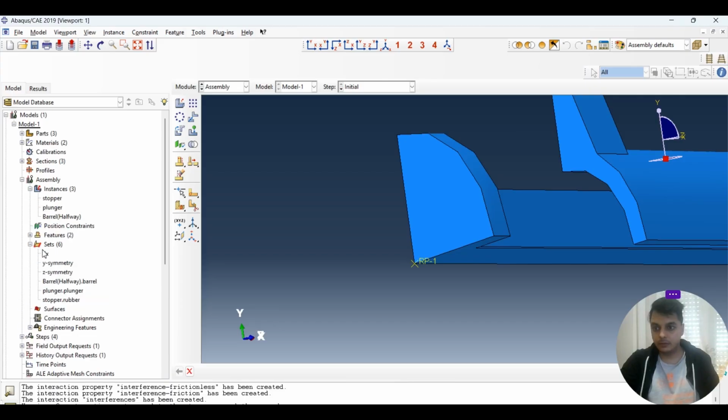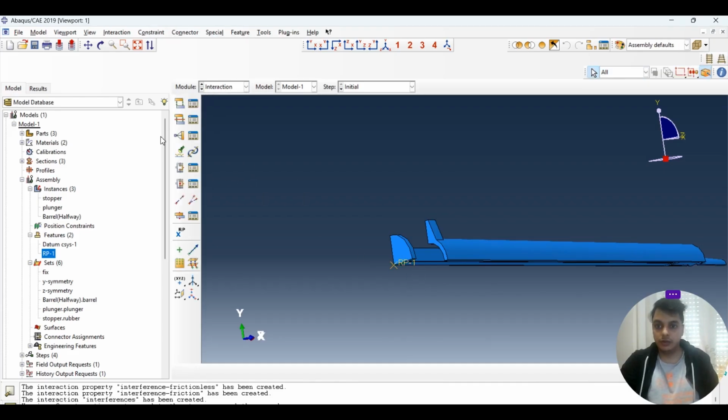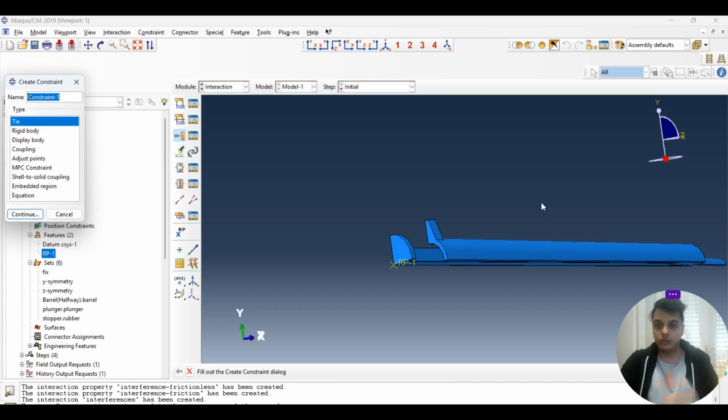We have sets, features, and we have features as a reference point. So you can rename it, but it's all fine as of now. And to couple it, we have to go again to the interaction. Then we have to do, let's say, coupling of all the points with this reference point.